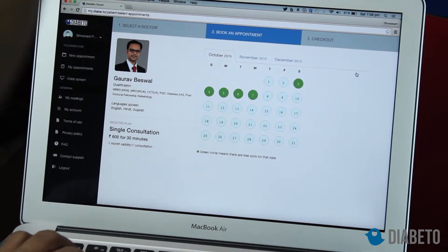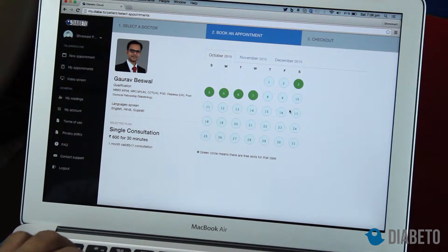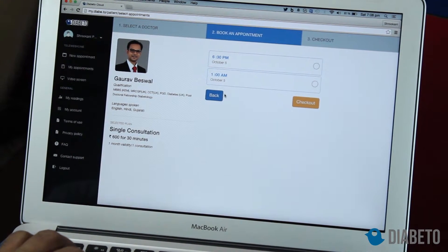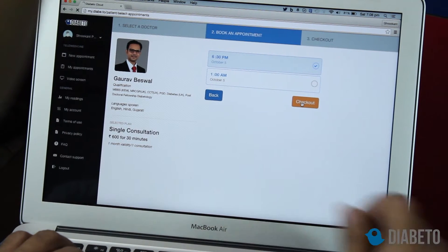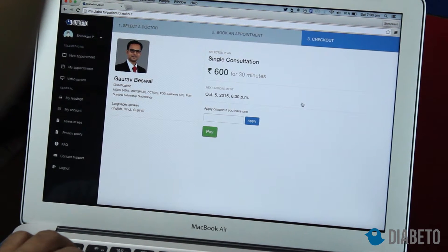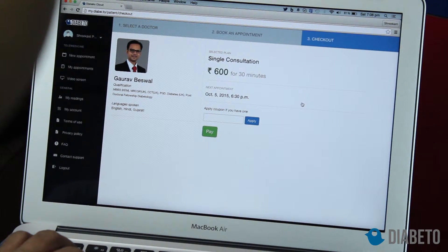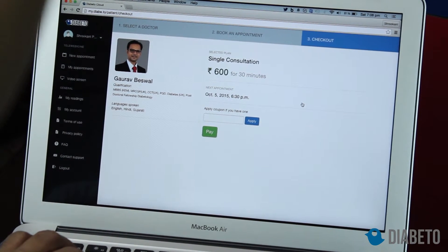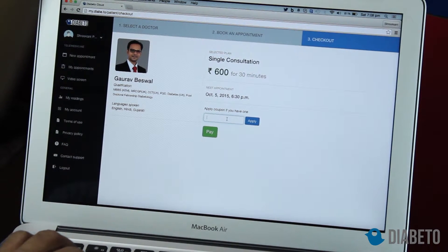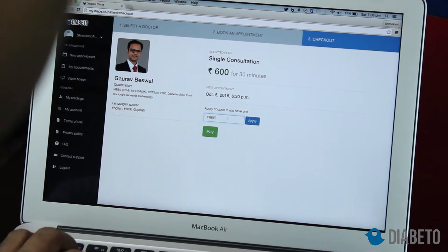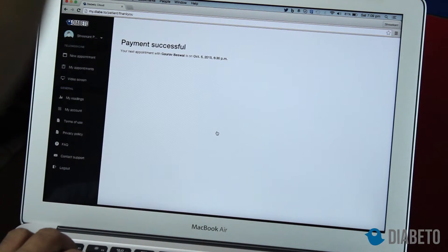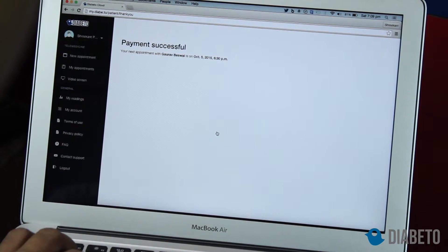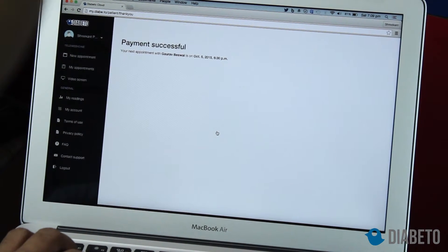I will select the time and date — I want a teleconsultation on the 5th of October. There are two slots free on the 6th of October, so I'll take the 6:30 PM slot and click checkout. The consultation is 600 rupees for 30 minutes. If you are testing the application you would get a free coupon code — I have one, I'll apply it and proceed. It says payment successful, the coupon was successfully applied, and my appointment with Dr. Gaurav Beswal on the 5th of October at 6:30 PM has been booked.